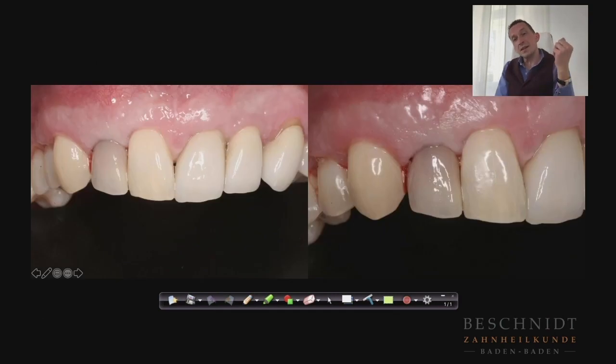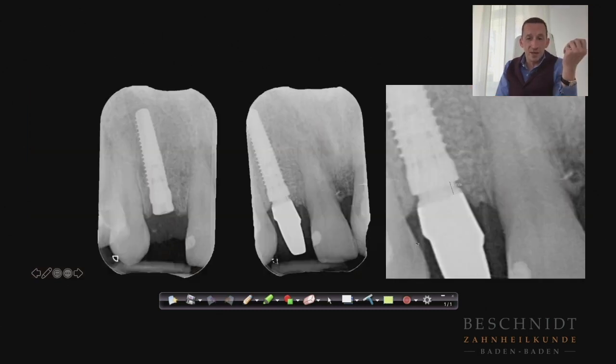So now this is the long-term provisional on the final abutment. And now we wait. And here again you see the height of the bone. So the implant still is beyond bony level. The luting base of the abutment is about 1 millimeter. At the moment we still have bony contact on implant shoulder.